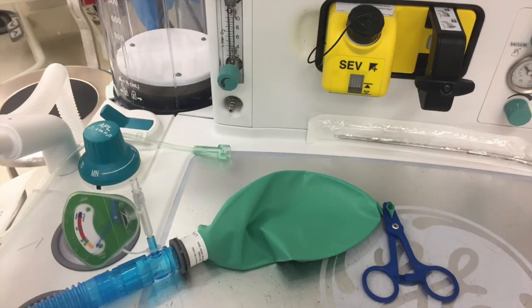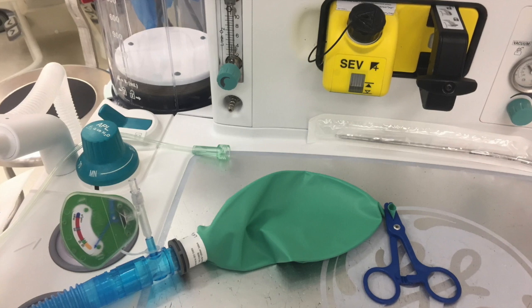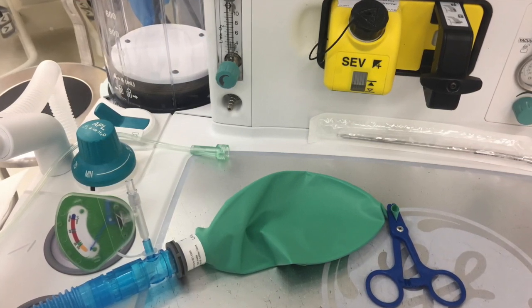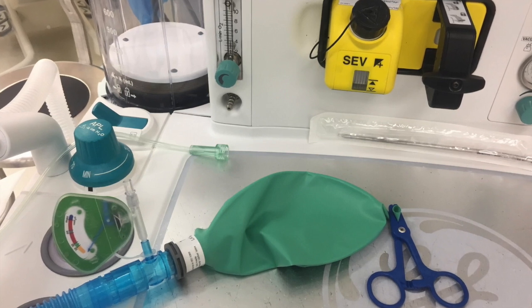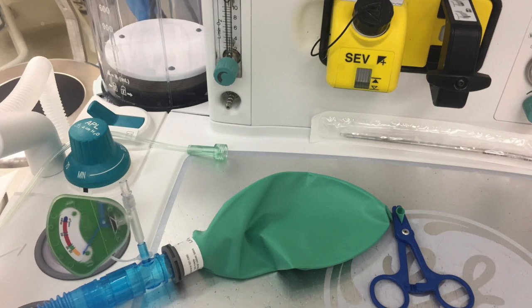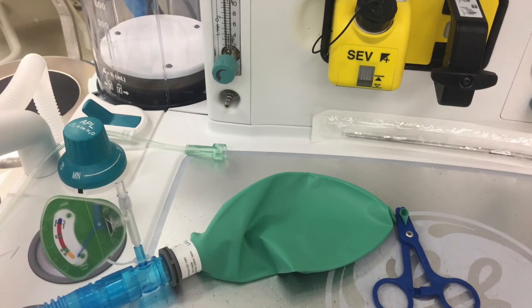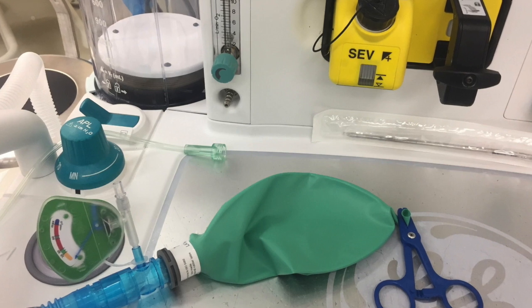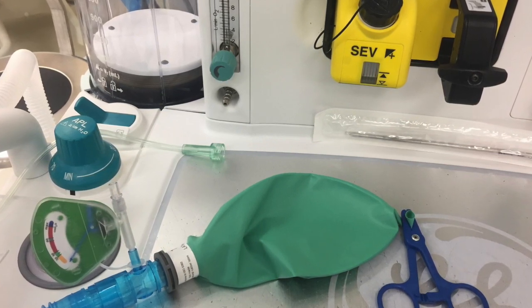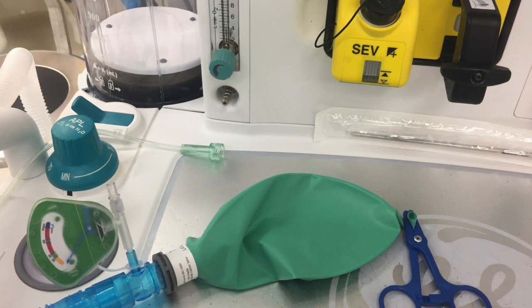Our manual ventilation bag resides, for most of the case, on the anesthesia ventilator table where it can be easily visualized. Here we see the circuit in monitoring mode. The snap is on the bag and, importantly, the oxygen tubing is not connected to the oxygen flow meter. This is a safe practice. The circuit with the snap on the bag is completely closed. If the tubing were connected to the flow meter and was inadvertently open, excessive pressures could develop within the circuit.